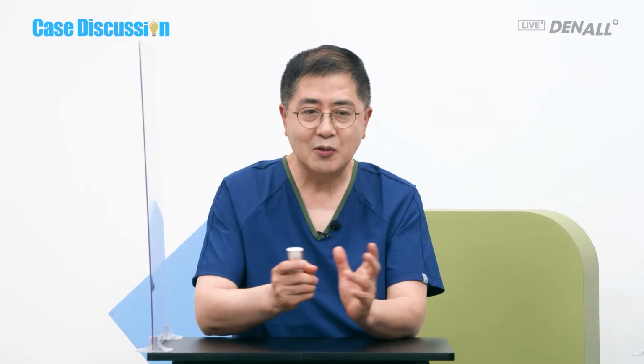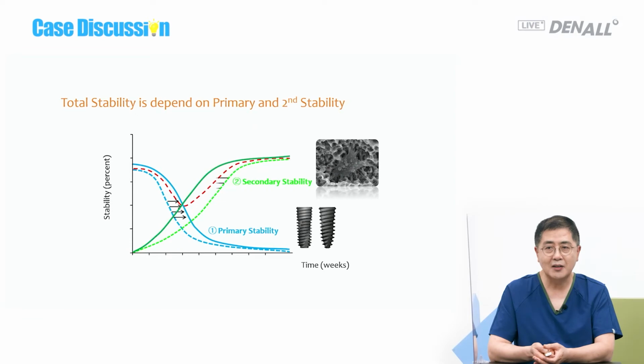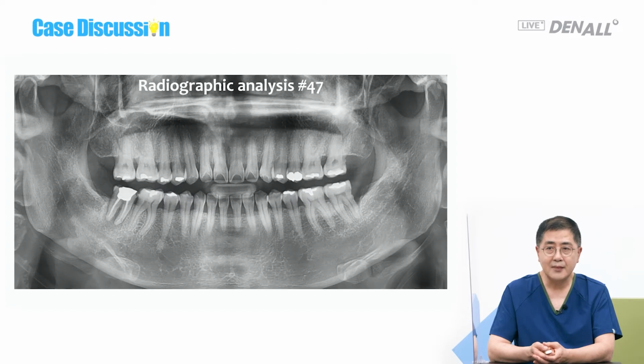I personally compared the surfaces BA or SOE and tested. BA and SOE also integrate much faster. With those implants, the secondary stability will happen faster. So ultimately, the total stability will go up faster, even though the initial stability was low.